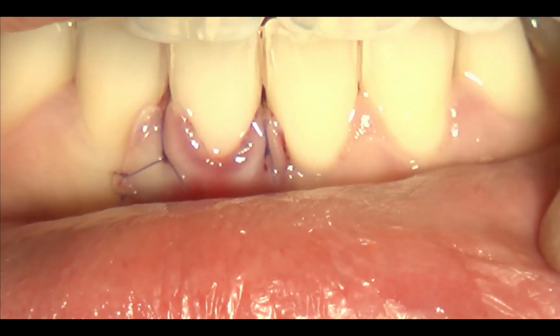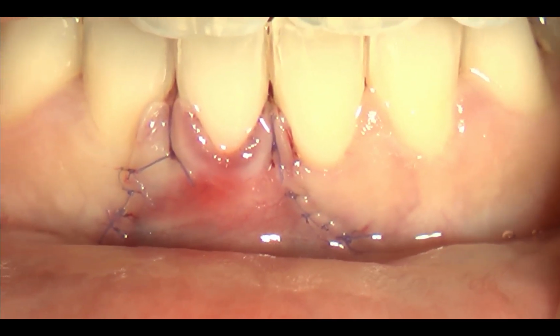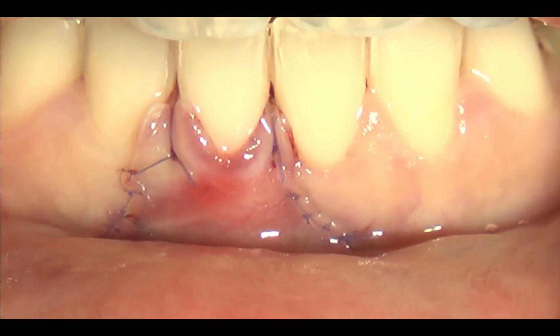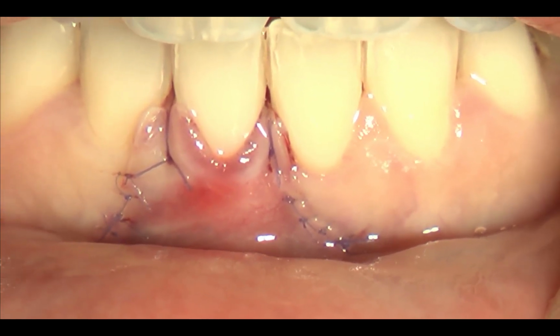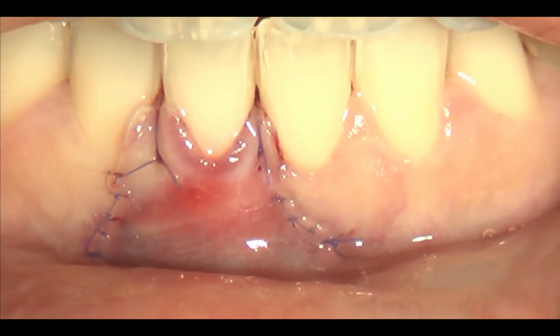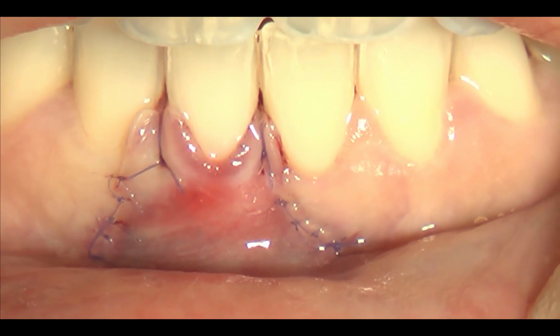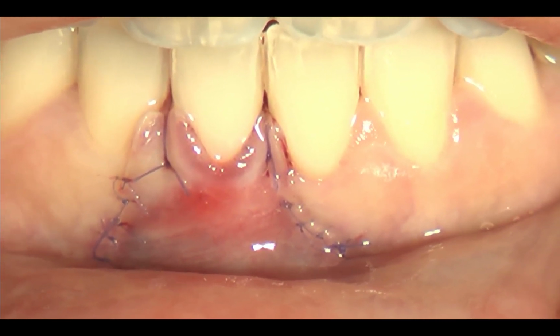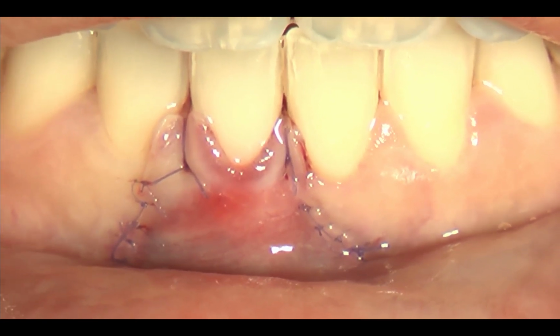It means that I really reach adaptation like a cord of the keratinized tissue to the convexity of the clinical crown. The root is covered in excess with the keratinized tissue, and the verticality of the vestibulum depth is replaced by the flap. It will be the graft that will give this verticality a long-term stability.